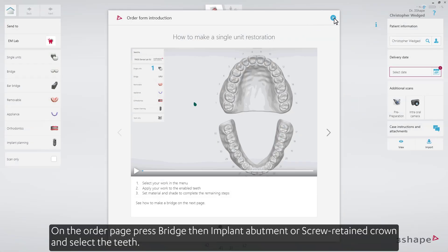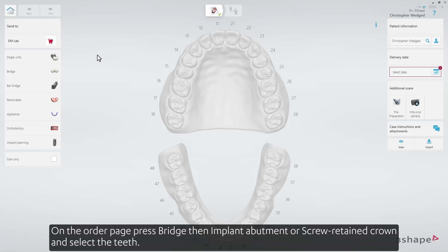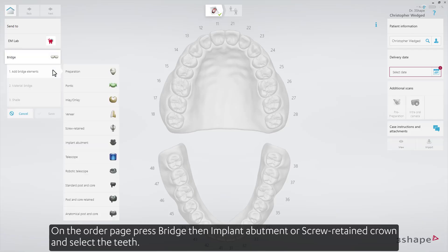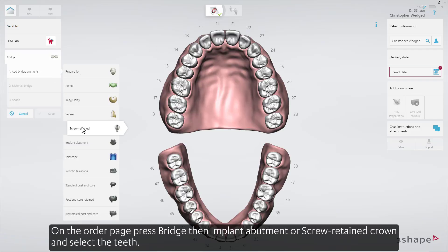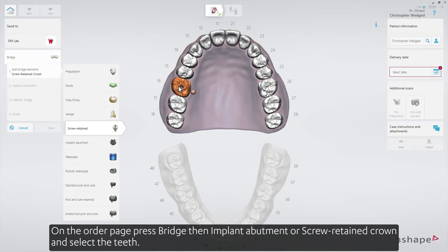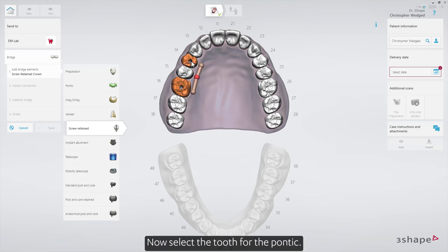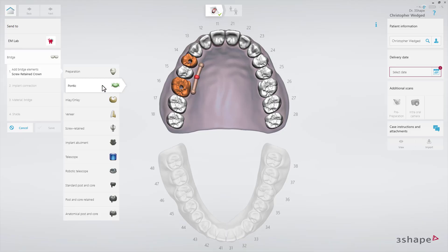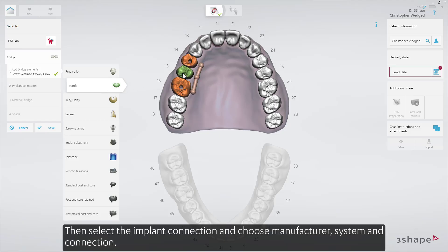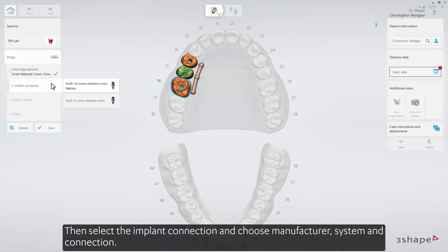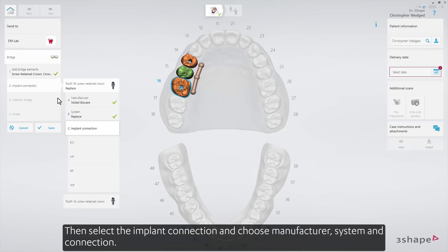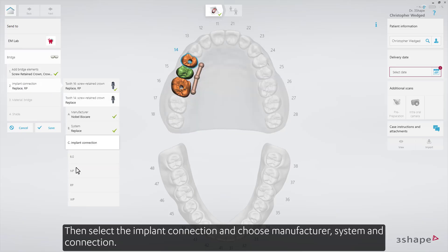On the order page, press Bridge, then Implant Abutment or Screw Retain Crown, and select the teeth. Now select the tooth for the Pontic. Then select the Implant Connection and choose Manufacturer, System and Connection.